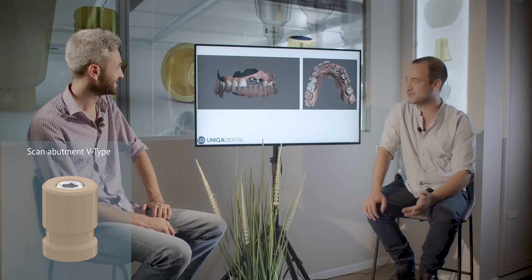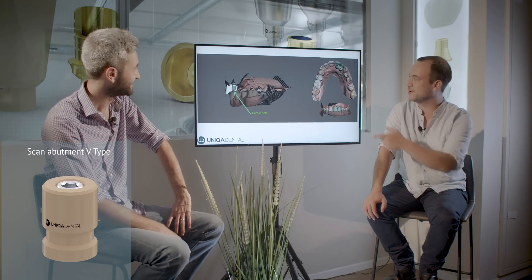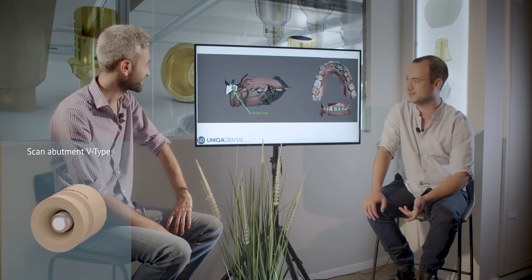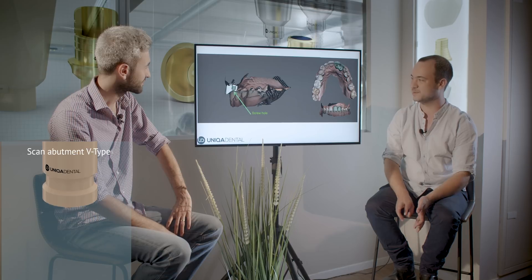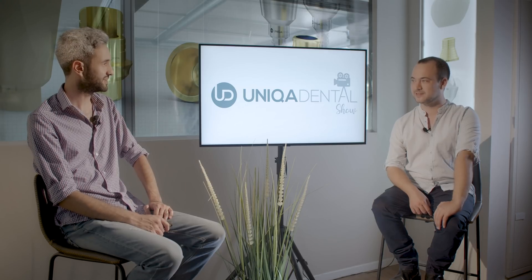In this case, scan abutments were also used. If you want to do zirconia, it's impossible not to use scan abutments — everything is digital. You can see from the models it was designed on Exocad and the bridge was later milled. You can't do zirconia without scan abutments. Intraoral scanning and CAD-CAM is an interesting topic that probably deserves another video.